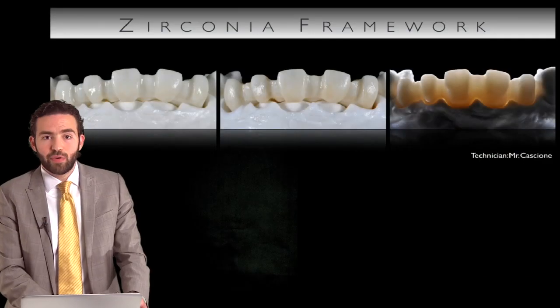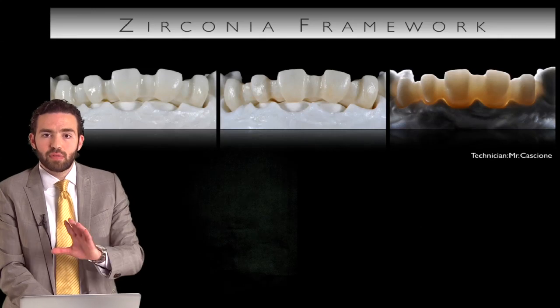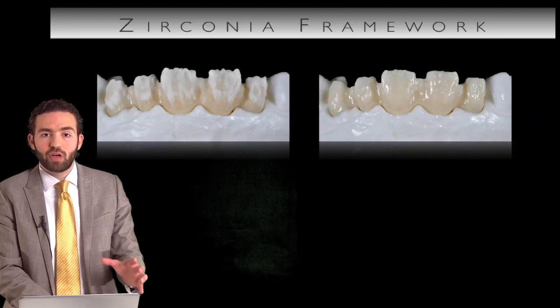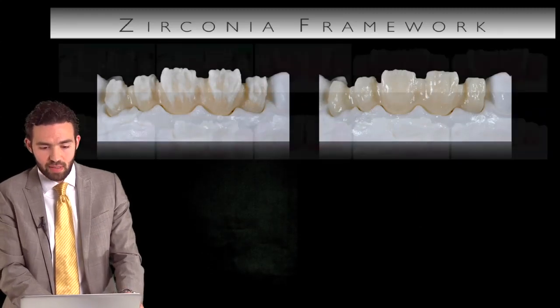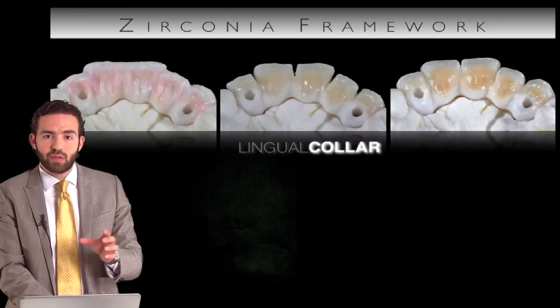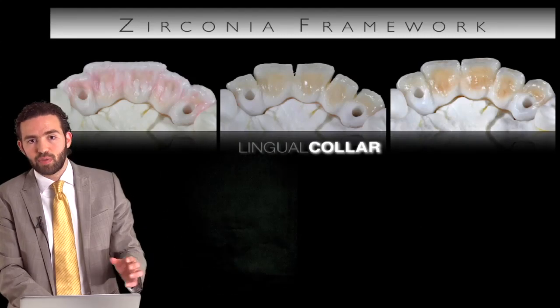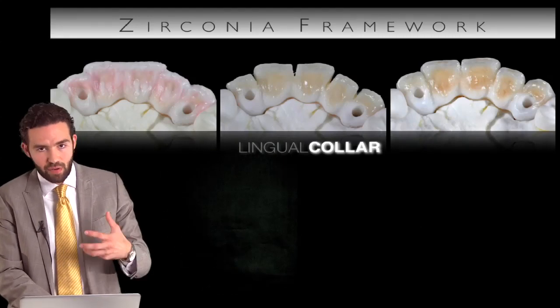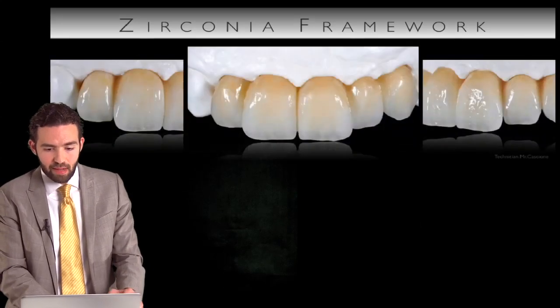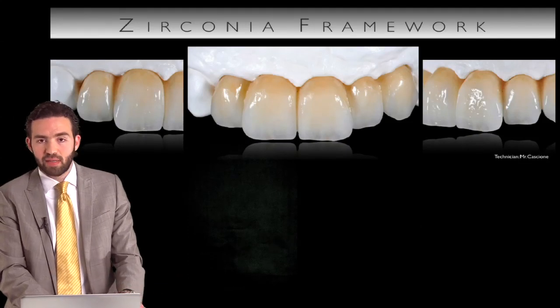Well, the same goes also for implant restorations, where we can also design our frameworks to provide lingual collars for those implant restorations. You see in this instance, the two implant restorations on the lateral and the canine position, where we added this lingual collar to provide additional strength for the fixed partial denture on the implants, and still the restorations can look beautiful and aesthetics is really not compromised at all.